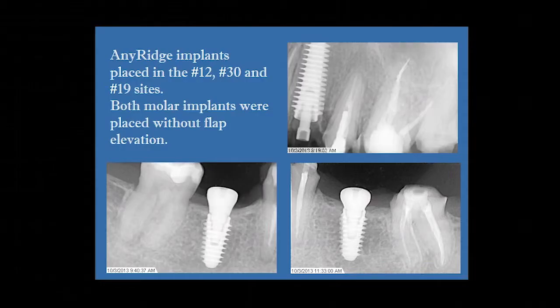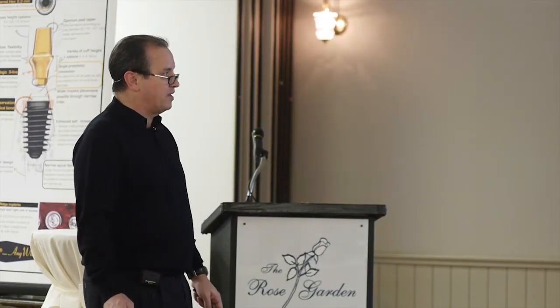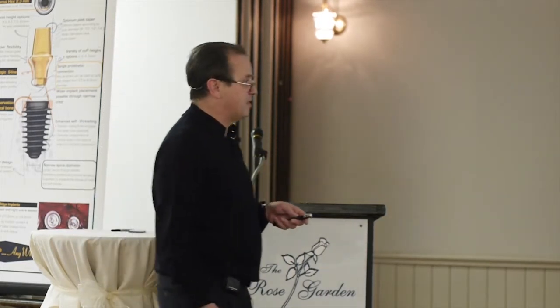These are some any-ridge implants that were placed, number 12, 30, and 19 sites. That was her case. And like I said, these things just grab that bone to the point that you feel like you could almost make your impression that day and make your final crowns then, which we don't do.